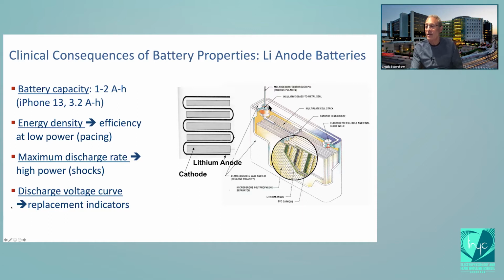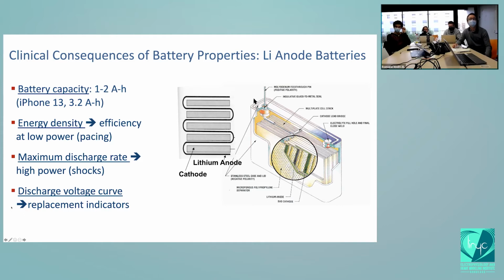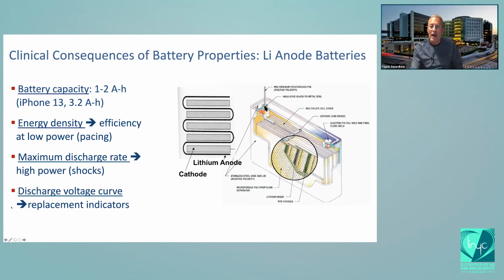That's what happened in that battery. There were older Medtronic and Biotronik batteries that had separator perforation problems. It's been a year or two since I looked at the SICD problem, and I don't recall that, but this is what happens in the Abbott pacemakers and in older Medtronic and Biotronik battery problems.